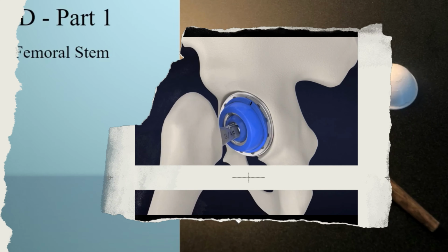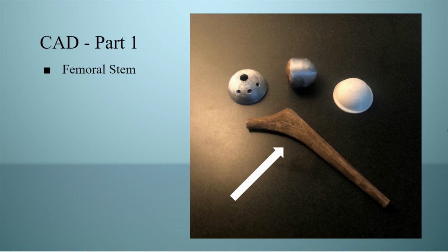A common method for displaying the functionality of a part or system is through 3D printing. Each part of the hip replacement procedure was designed using CAD, and shown in the picture. The femoral stem provides support for the femoral head, or the ball of the hip joint. The femoral head sits on top of the stem and allows for smooth movement and rotation of the hip joint.